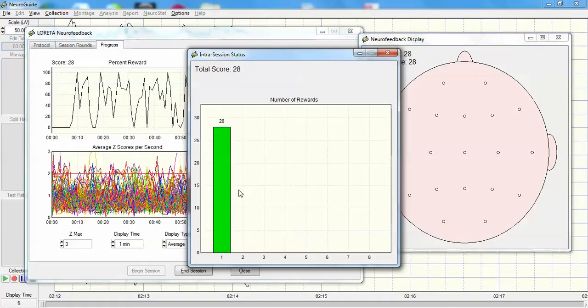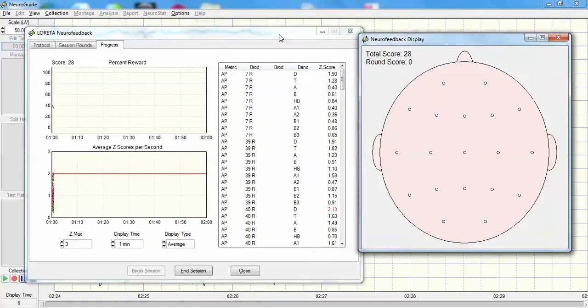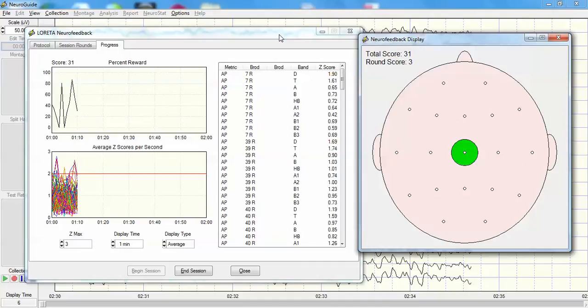And we want to be able to see a progression over sessions of control by the patient of the display, which indicates that learning has occurred or operant conditioning has occurred, in which the brain has been modified by virtue of EEG biofeedback. And specifically what is being modified are the Brodmann areas or the nodes of networks and the connections between those nodes that are linked to the patient's symptoms.